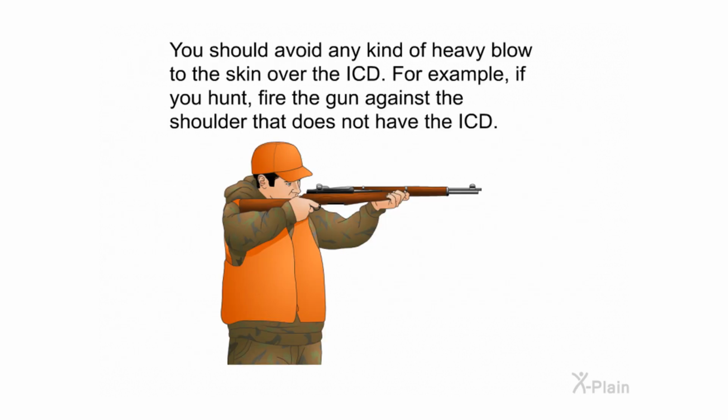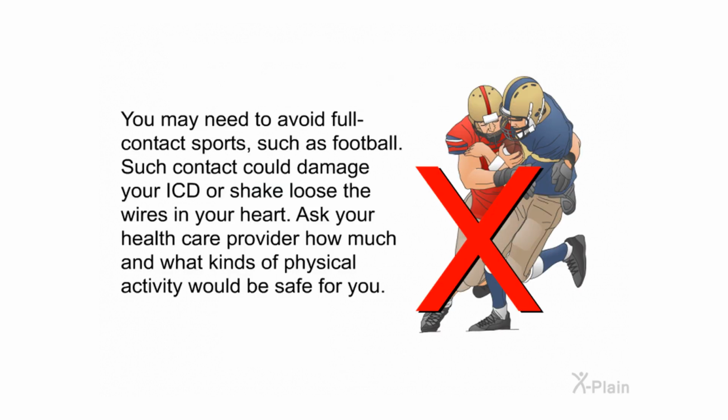You should avoid any kind of heavy blow to the skin over the ICD. For example, if you hunt, fire the gun against the shoulder that does not have the ICD. You may need to avoid full-contact sports, such as football. Such contact could damage your ICD or shake loose the wires in your heart. Ask your healthcare provider how much and what kinds of physical activity would be safe for you.